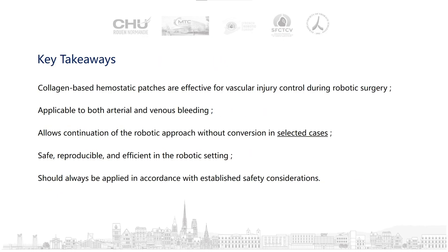In our experience, collagen-based hemostatic patches have proven to be effective for controlling vascular injuries during robotic surgery. They can be used for both arterial and venous bleeding, and in select cases they allow the procedure to continue robotically without the need for conversion. They are safe, reproducible, and efficient within the robotic setting, but should always be applied in accordance with established safety considerations.